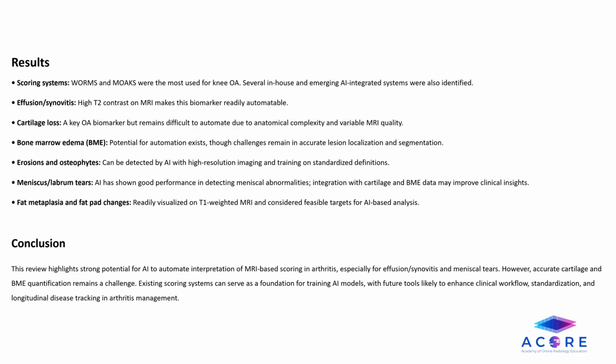On the whole, this review highlighted strong potential for AI to automate interpretation of MRI-based scoring in osteoarthritis, especially for effusion and synovitis as well as meniscal tears. However, accurate cartilage and bone marrow edema quantification still remains a challenge. Existing scoring systems can serve as a foundation for training AI models, and these future tools are likely to enhance the clinical workflow, improve standardization of different quantification methods, and improve longitudinal disease tracking when managing osteoarthritis as well.